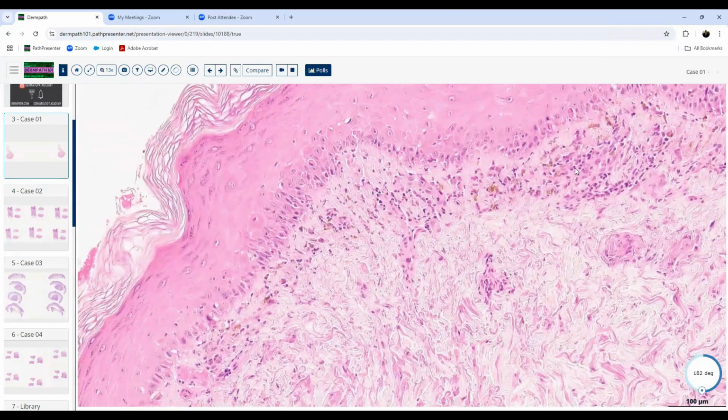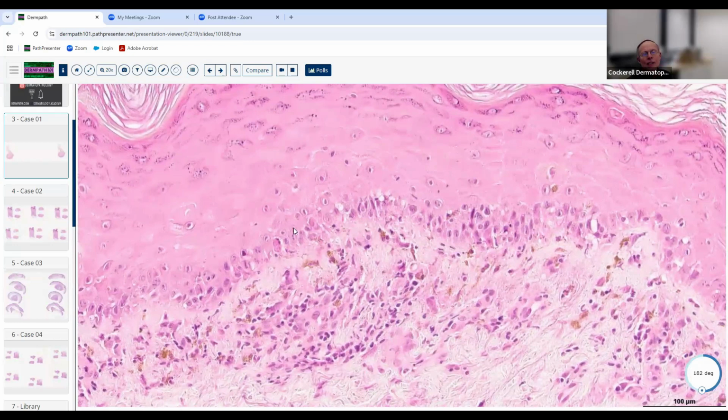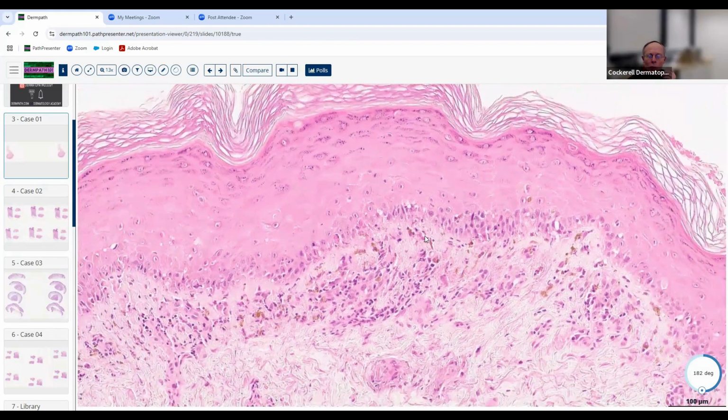Epidermotropism. Yeah, good. There's really no epidermotropism, and you can rarely get dyskeratosis in mycosis fungoides. I've seen it a few times, not very many. Not commonly seen, so that's not great for it. So we'd probably say it's chronic, that goes along with it, but there's really no epidermotropism, and this dyskeratosis is unusual.